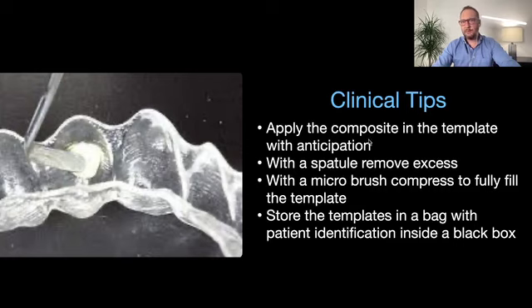So I like to apply, you probably know, right? But with the attachments, you have a template. I'm going to show you a plastic. It's not an aligner. It's in a specific bag for the attachment template, where we are going to apply the composite over this area, which you are going to transfer to the patient's mouth, okay? So this way you can be assured that the same attachment that you place in the computer, you're going to transfer to the exact same position by using this attachment template, okay?